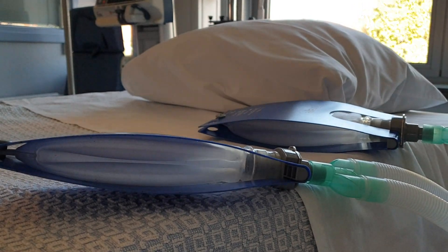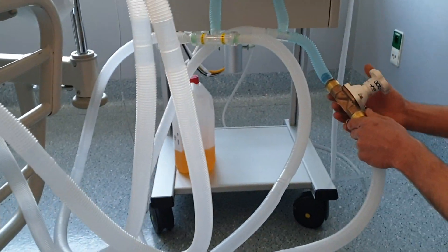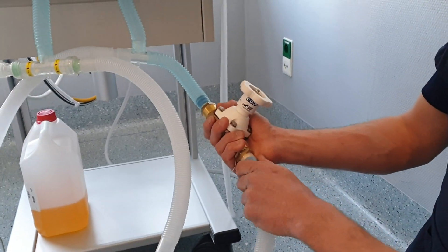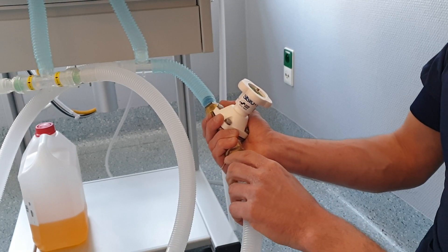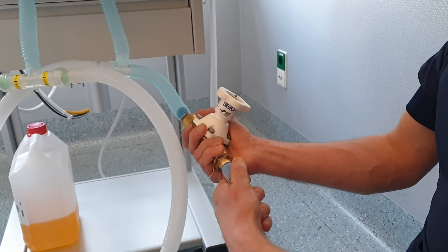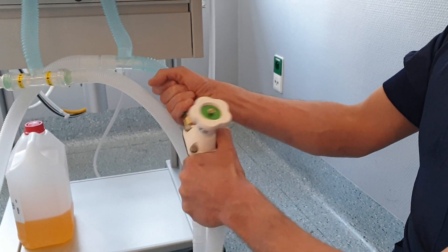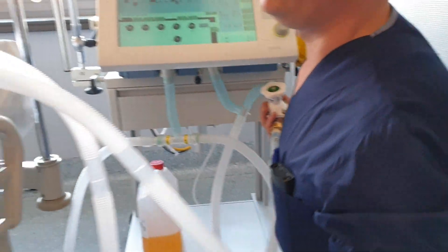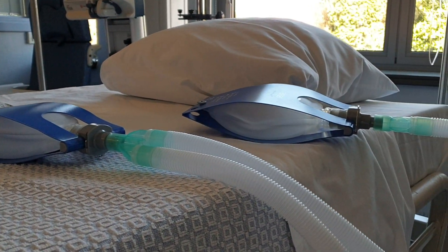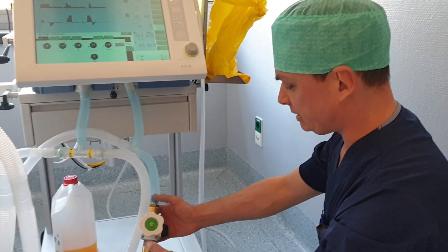This is just a standard valve you can buy at any plumbing or do-it-yourself shop. The diameters of our tubes are 22 millimeters internal diameter and you can easily disconnect, so it's plug and play. Just get some valves at your local plumbing shop and put them on your tubes. It's so easy.